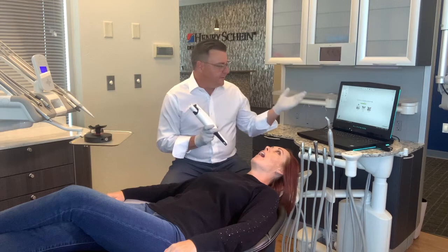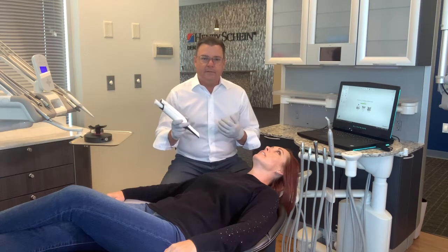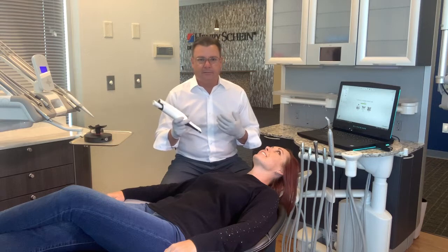I'm going to start with the lower arch, as the software indicates that's where we start. I'm going to do the occlusal surface, the lingual surface, and then the buccal surface.